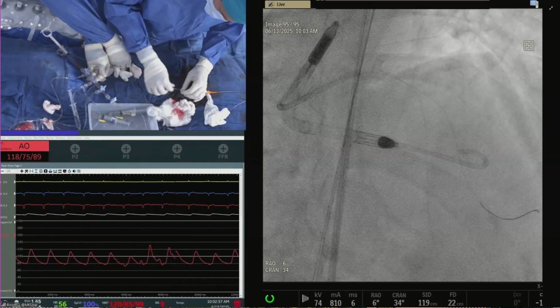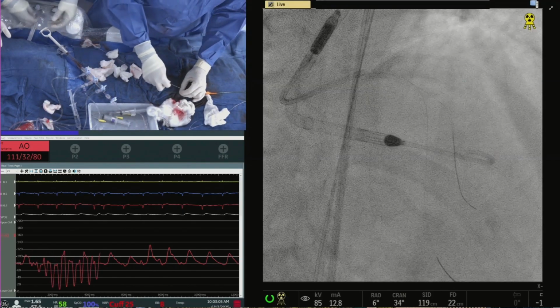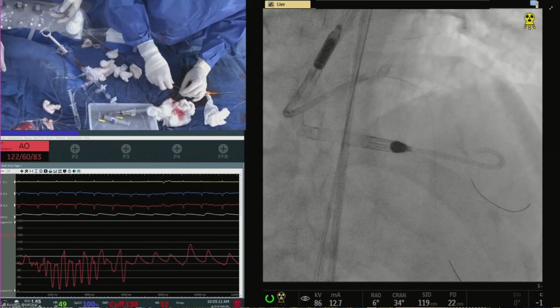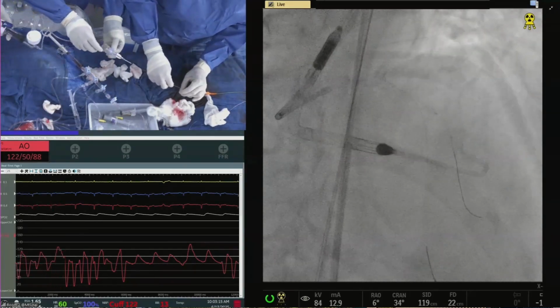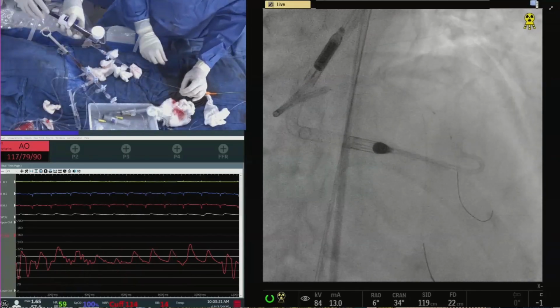We have the algorithm for management of calcium that came out in JAMA Cardiology, as well as what we presented at ESC last year, the management of calcific nodule, because that is where all the discussion is. Yes, we do imaging, we see things, and then which device do we use?